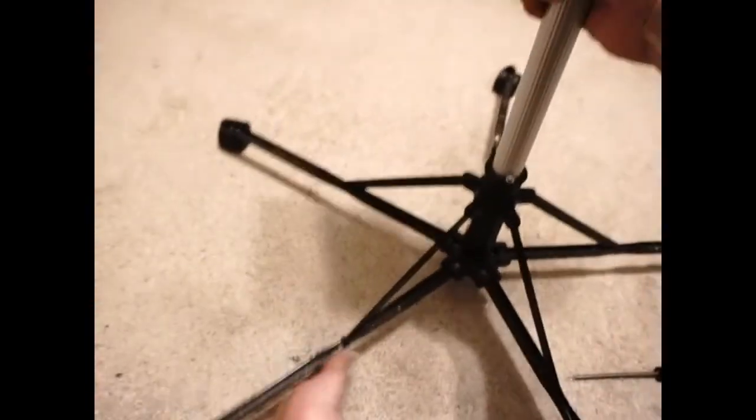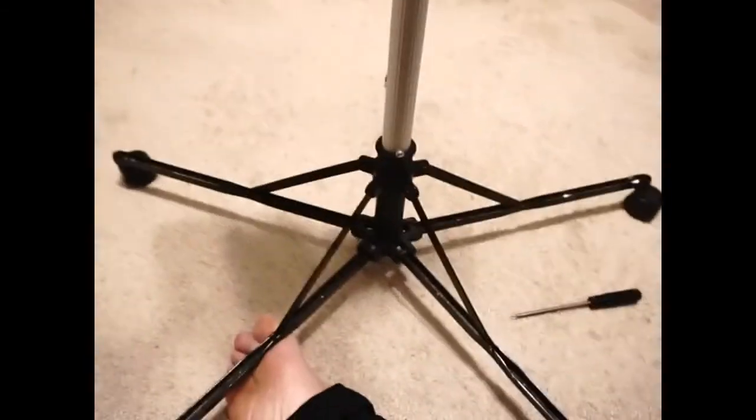Excuse my mess in the background — we're cleaning out and getting things ready for donation. Now I'll show you how to put it on the pole. You just pop it on. If you find it hard to get it around the pole, you can bend the clamps slightly to get them to slide around and then pop them on, then secure them back. They're steel so they won't be permanently damaged by a slight bend.